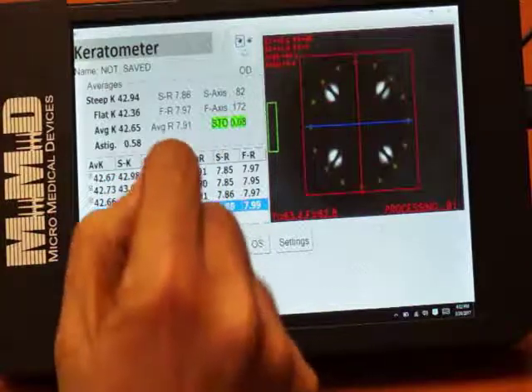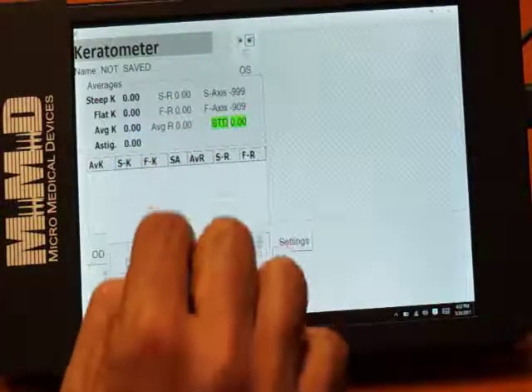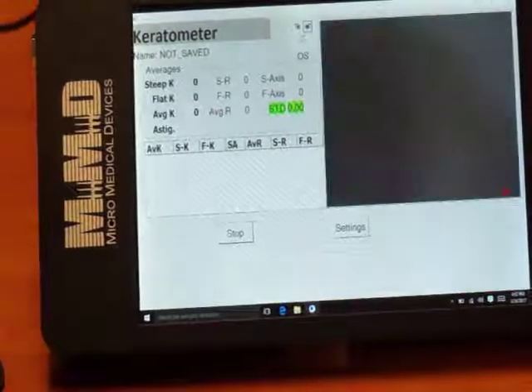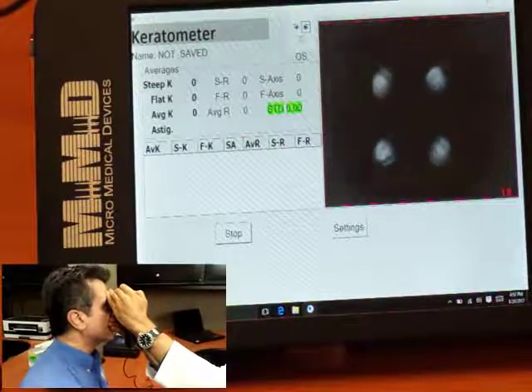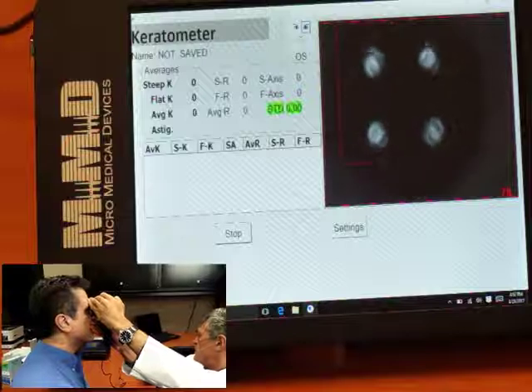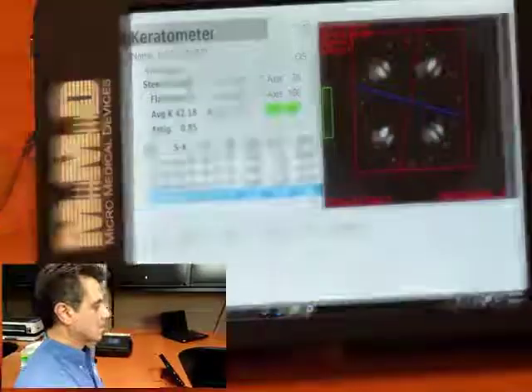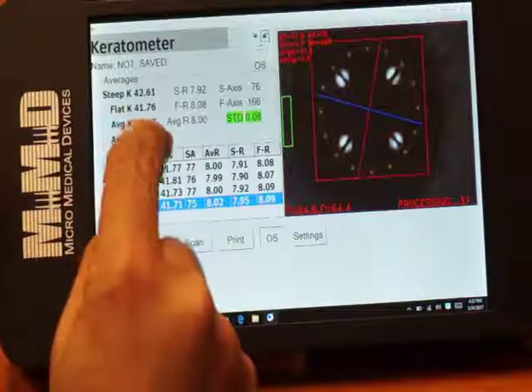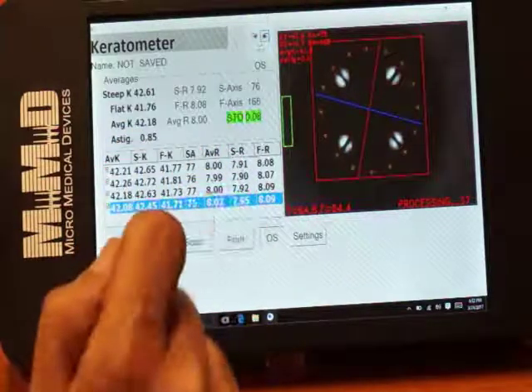I'll show you again. I go to the other eye. You can see the square change to the fellow eye. Scan. I ask the patient to look straight, put the four dots in the center of the pupil, and slowly go in and out and in and out. Okay, and I got the measurement. In this eye the measurement is 42.18, standard deviation again is 0.08, and again about 0.85 diopter of astigmatism.